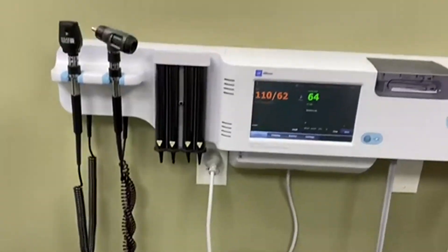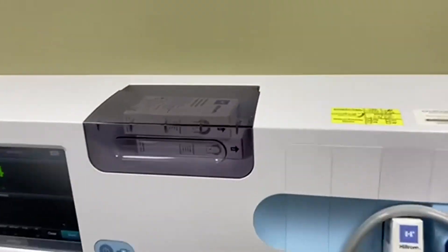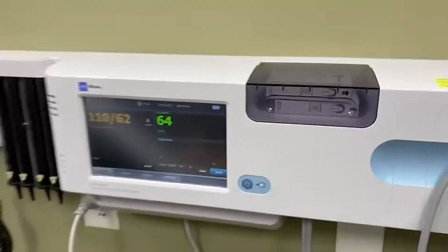It's all right at the same level and within arm's reach, so it makes the check-in process and examinations really, really fast and easy.